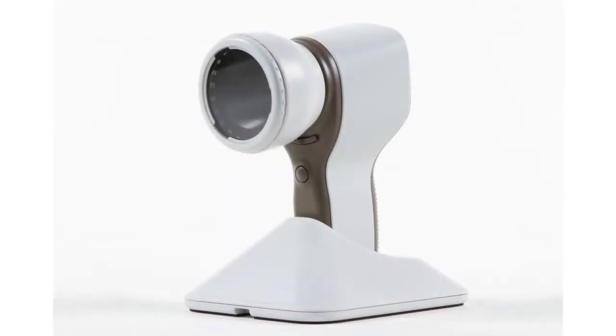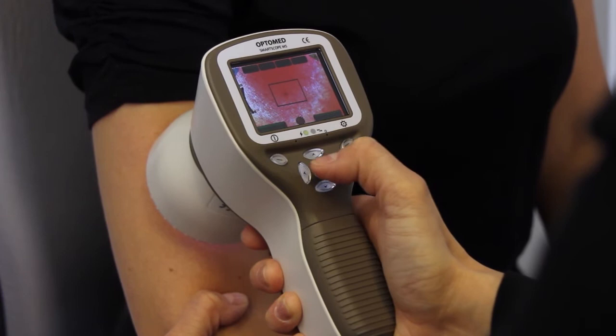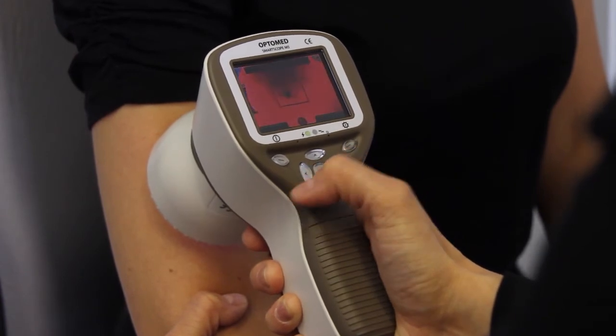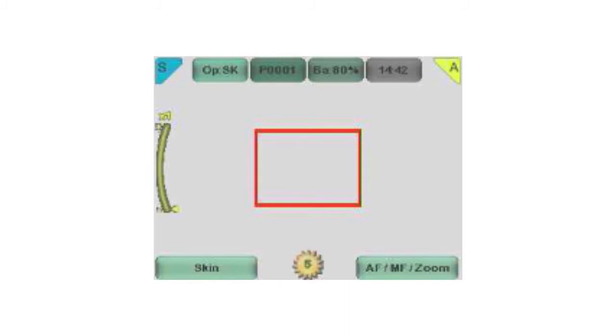Illumination level. The camera has 360 degrees of white LEDs as a light source. The level of illumination is adjusted by pressing the left and right arrow keys. Altogether, there are 10 brightness levels with a default value of 5.